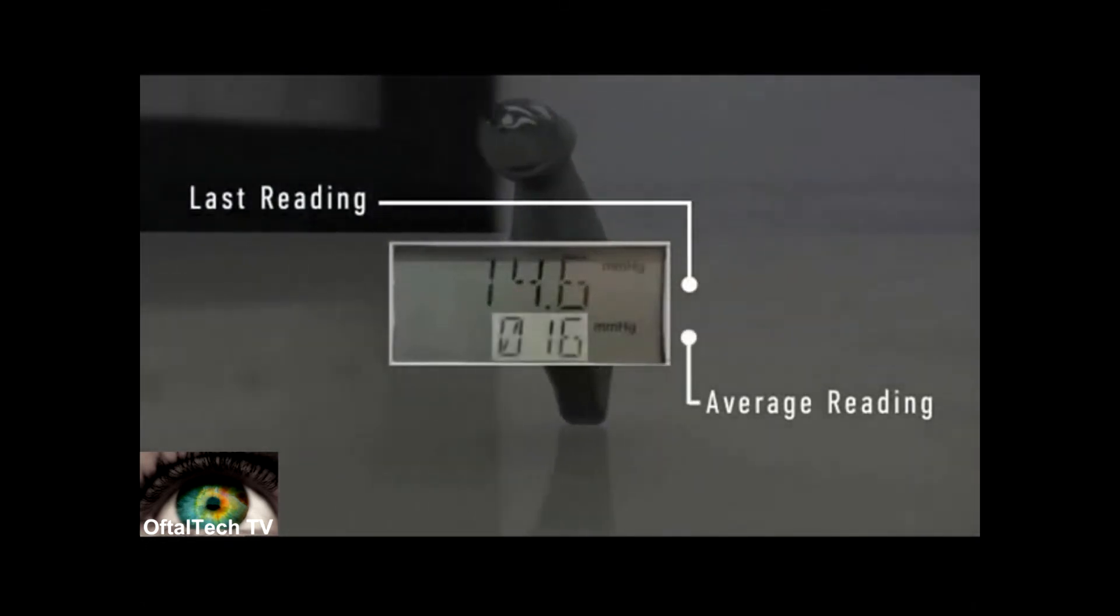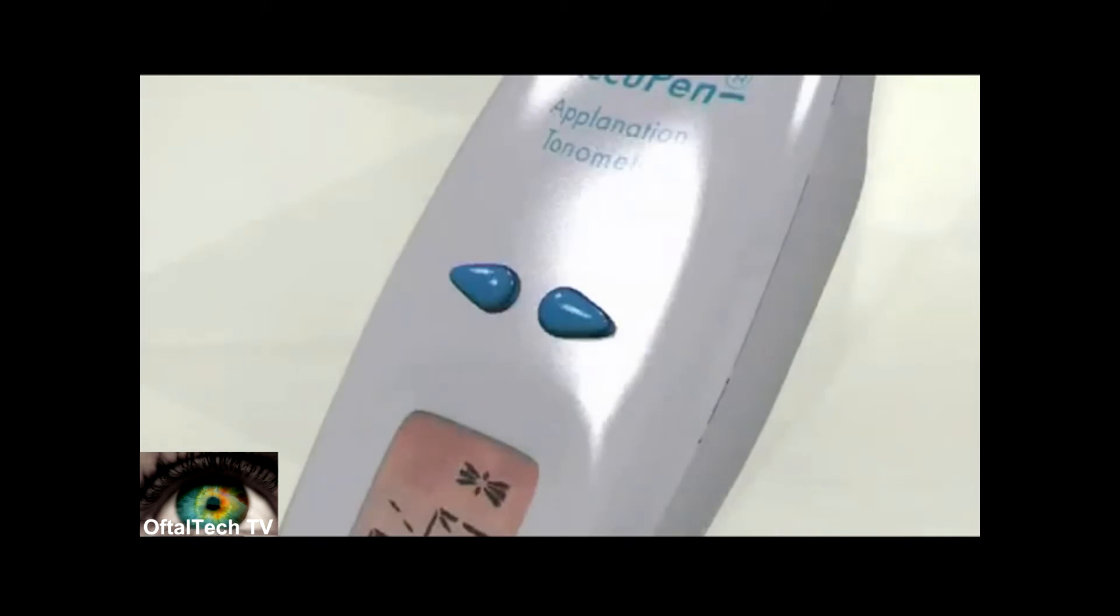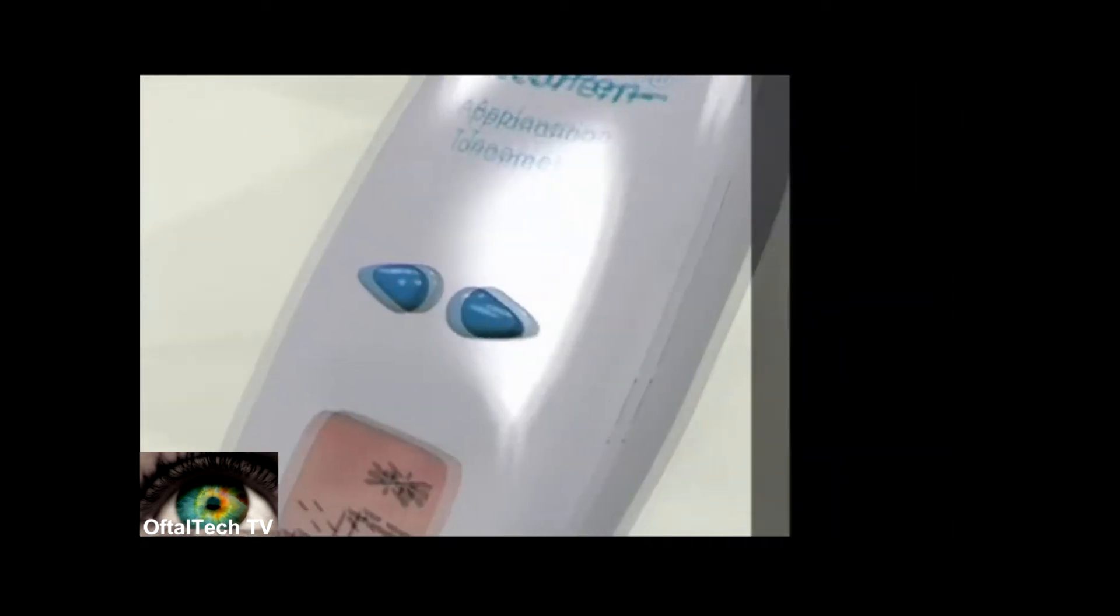To scroll through multiple measurements, simply hit the arrow buttons. If you have taken multiple measurements, an asterisk next to one of the numbers will indicate the furthest from the average. To delete individual measurements, hold down one of the arrow buttons for approximately three seconds. The unit will chirp indicating the measurement has been deleted.